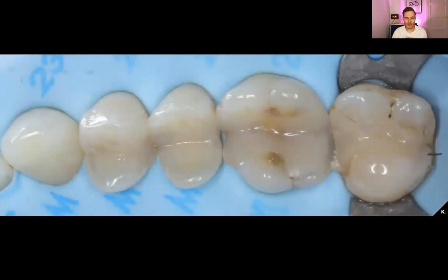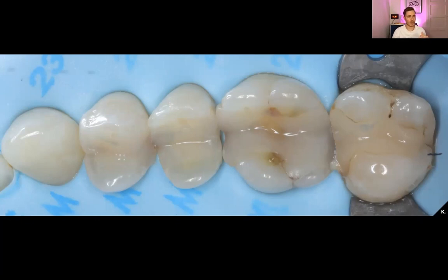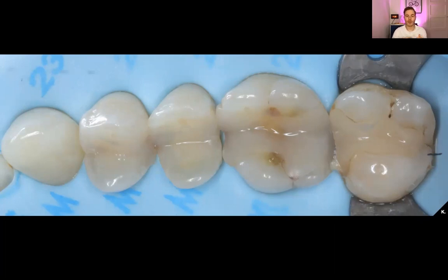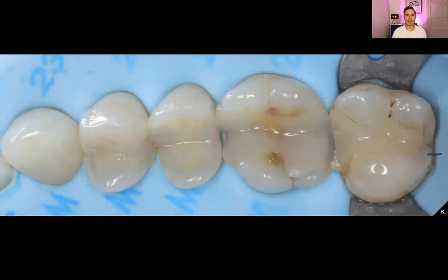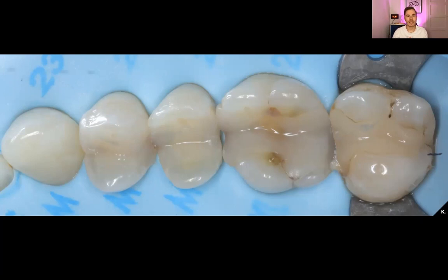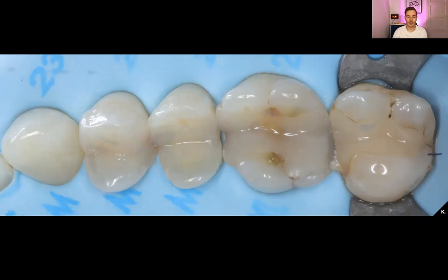Here we can see the situation after isolation. Since I only had two hours for this appointment, which was a bit short, I decided to start with the molars first. I first removed the restorations in the first and second molar, since I didn't know how much time it would take me to finish this case and I don't want to prep all the teeth and then find out that I need way more time. So I decided to start with the first and second molar first.